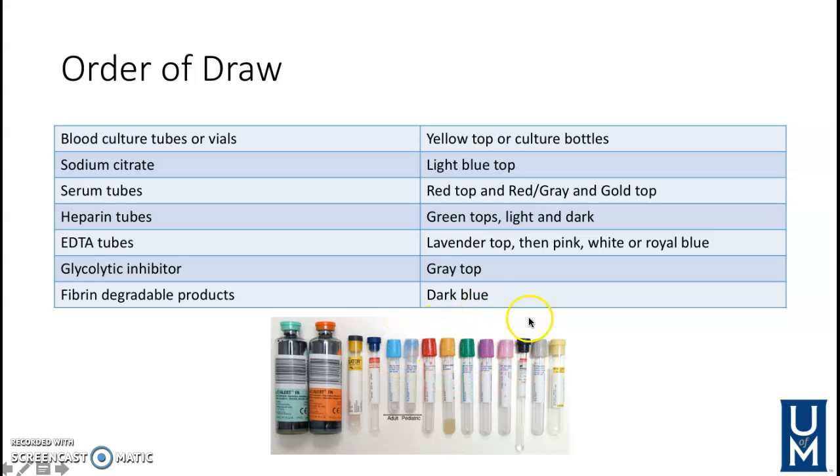Now you'll see that there are some other colors that are not mentioned here. These are our most popular colors, and that's why I've only included these. If you have additional tests, you may actually refer to the lab as far as which one you would grab first. So you may be thinking, how in the world am I going to remember what order to draw these labs in? Well, I have a helpful mnemonic, and I'm grabbing it out here. A helpful mnemonic to help you remember the order of this draw. So if you guys want to write this down, it will be helpful.